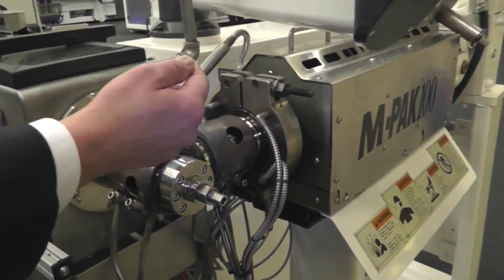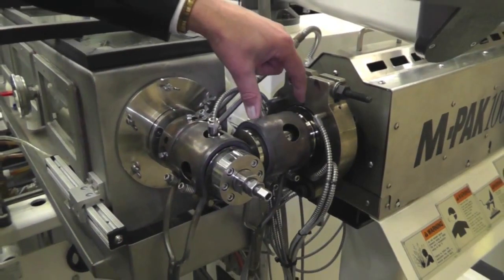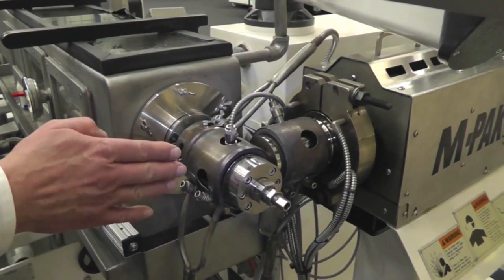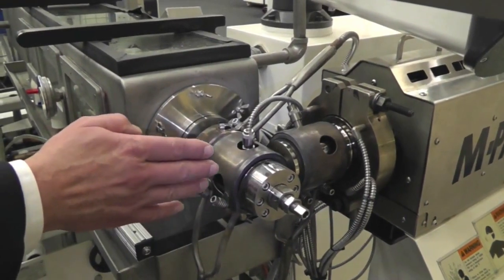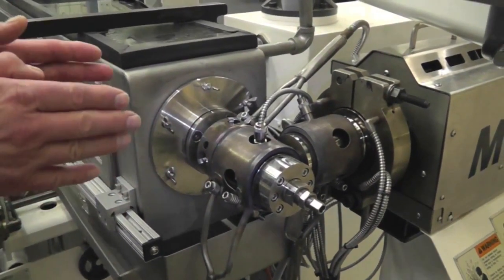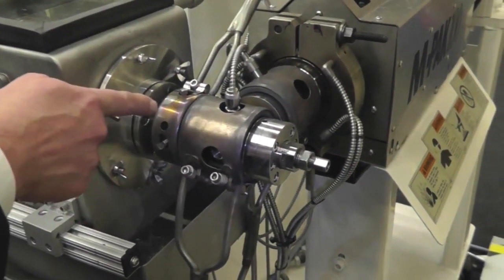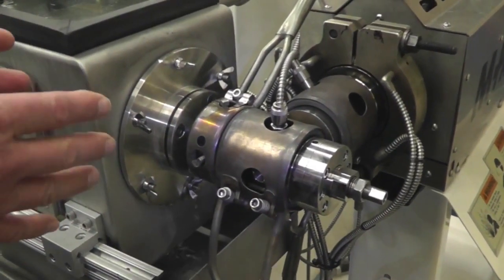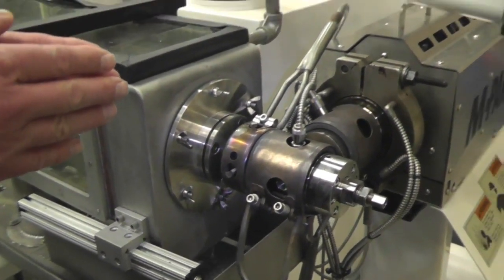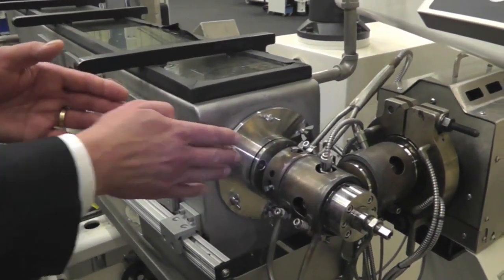We come out to the exit end of the extruder into what we call cross tooling. The melt flow comes in and goes into the cross head, where the tooling changes the material flow direction to the inline direction. Inside there we have a tip and a die: the tip forms the inside of the tube, the die forms the outside of the tube, and then it exits into the tank.